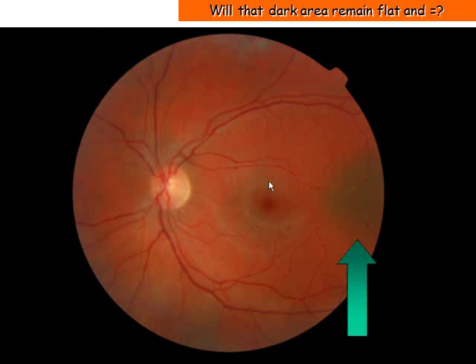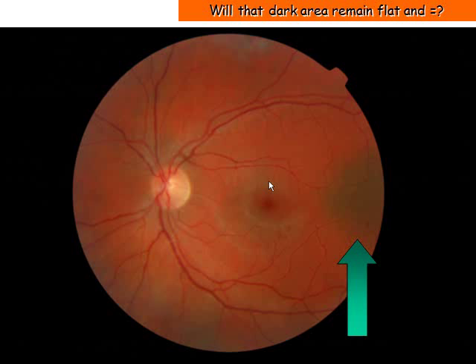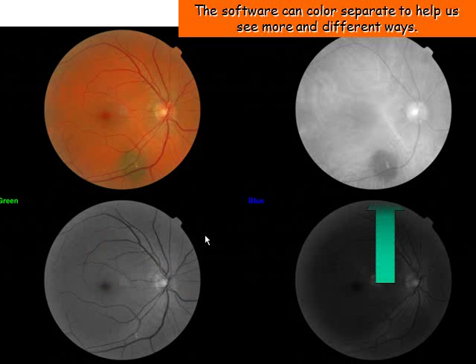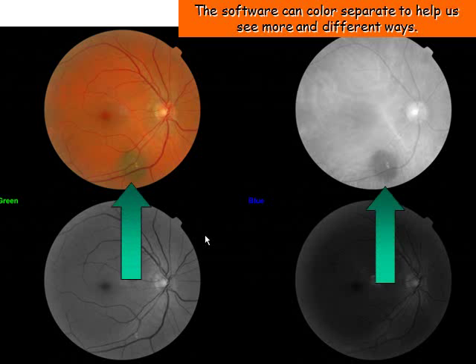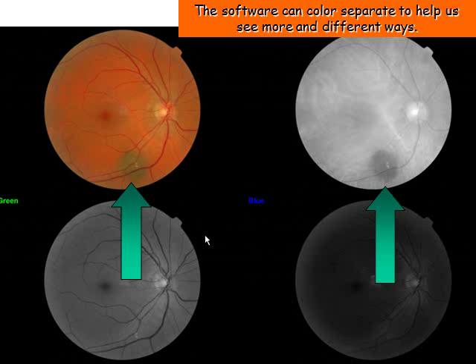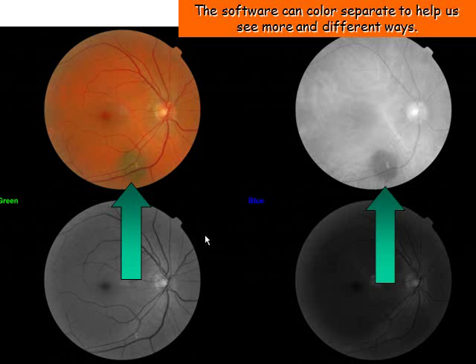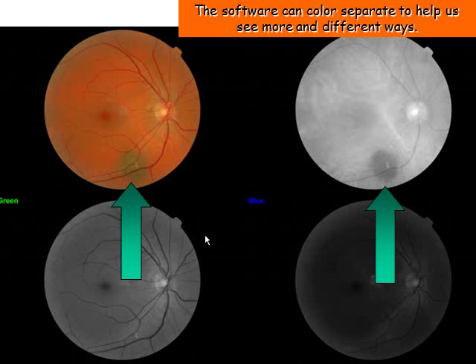In this image, will a dark area remain flat or develop into something? With the new fascinating technology, the software we use can help separate color to help us see more of your eye and in different ways.